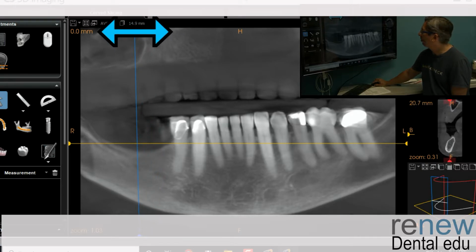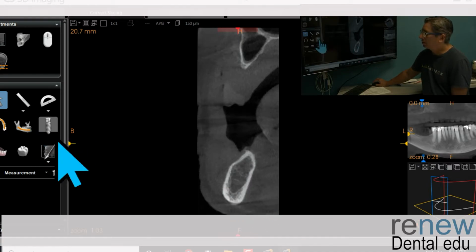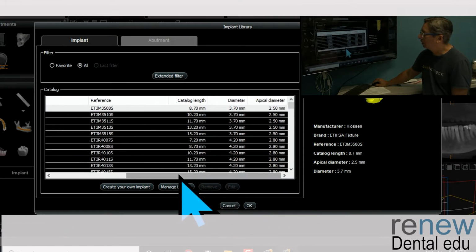Maybe about that part here. So you're right here. The nerve is still here. And now you still have very, very soft bone here. And let's see what you could do if you wanted to try something crazy.